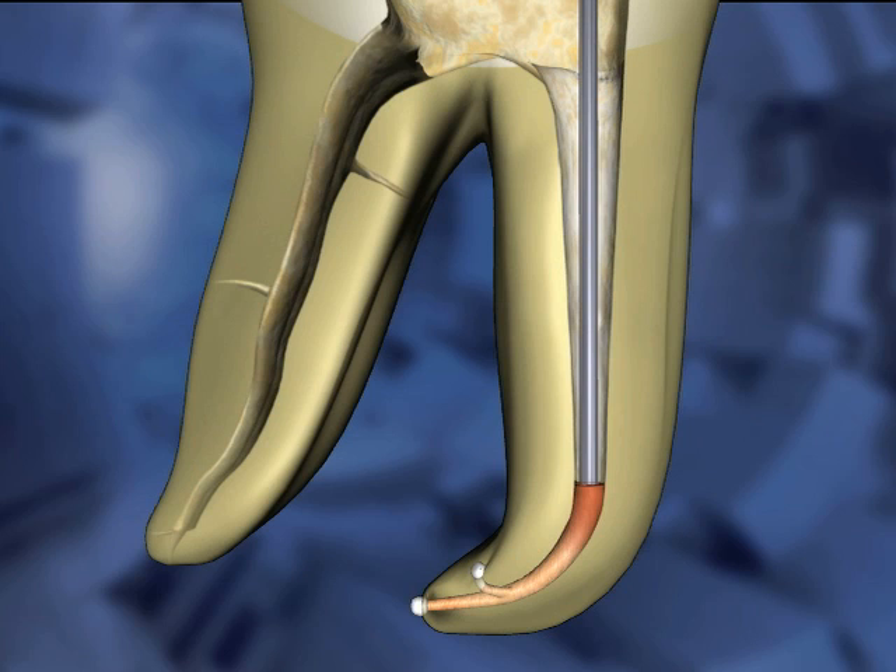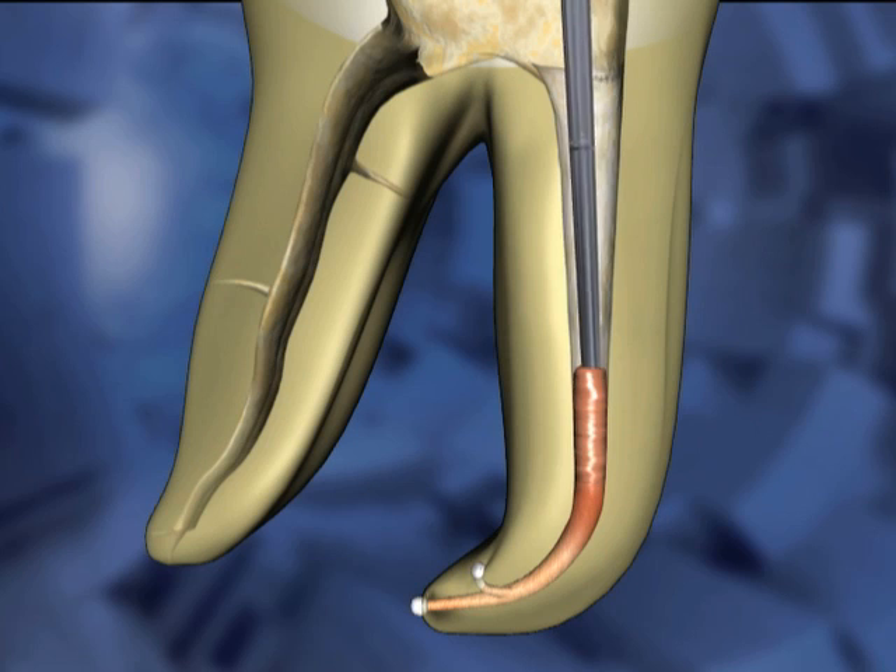Press and hold the activation cuff on the handpiece to begin the flow of gutta-percha. Allow the flow to gently push the handpiece a few millimeters coronally. Release the activation cuff to stop the flow. Remove the Calamus handpiece and use a small pre-fit plugger to compact and adapt the material.